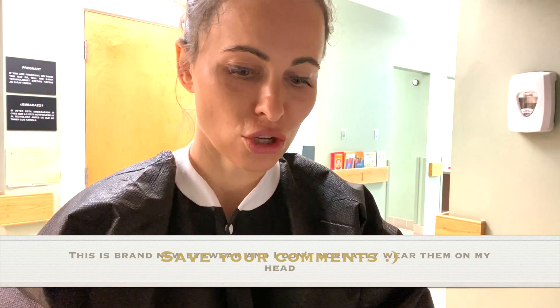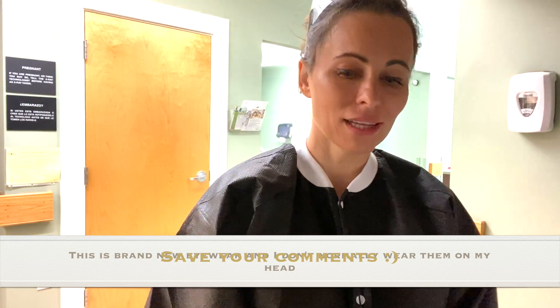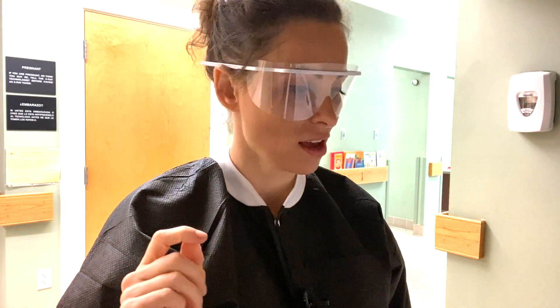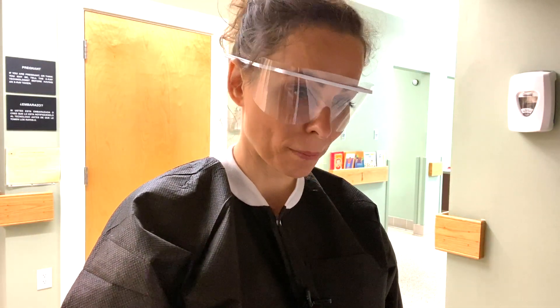I'm going to shock the water lines with the bleach water solution - diluted bleach - which I printed off from Pro Edge Dental dot com. I brought all of my bottles to my sterilization area and I'm going to wear my protective stuff, my eyewear, my utility gloves, and make sure that I don't get bleach on me.